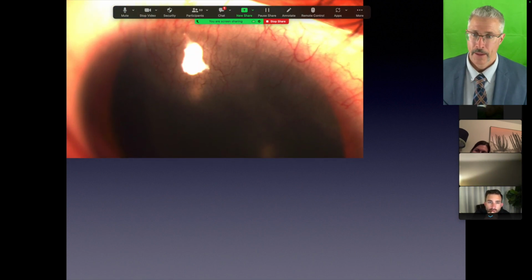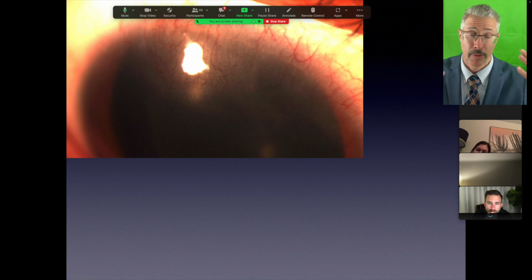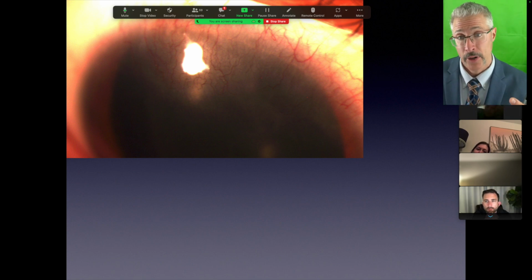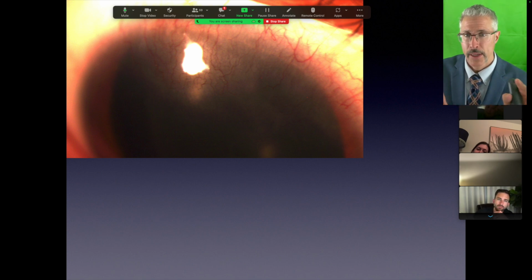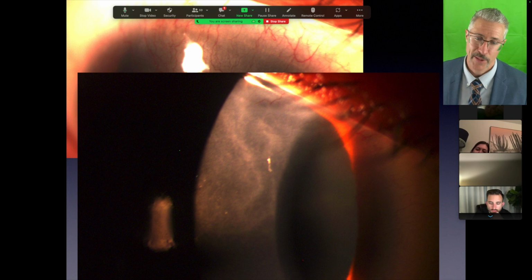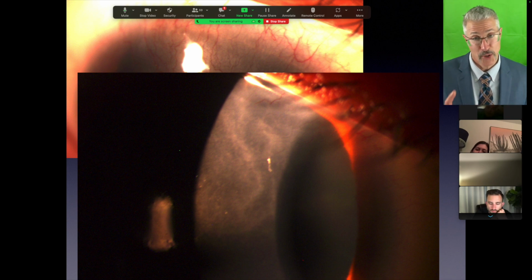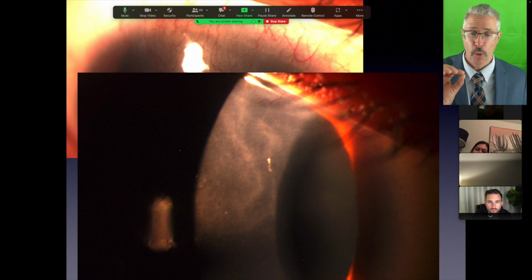So here's what it can look like. Kind of hard to see the gray cells. I see the blood vessels growing in and a little bit of extra opacity with iris as a backdrop coming from these vessels, like they're leaking opaque things. But to see the epithelial cells, remember, even with the pupil as a backdrop, you want to make it extra dark and then really light up that cornea selectively.